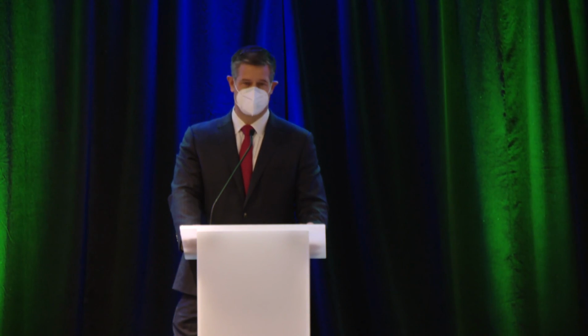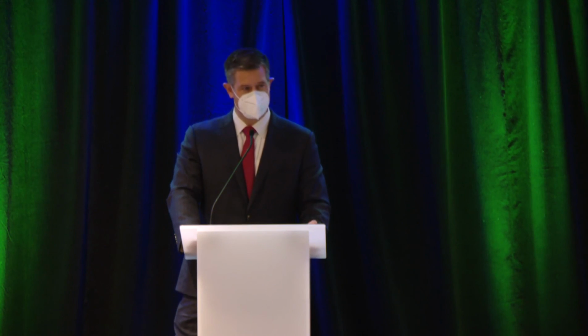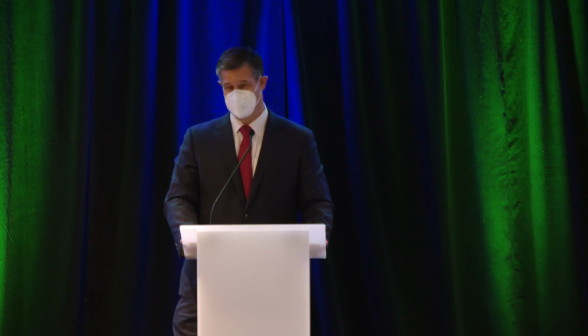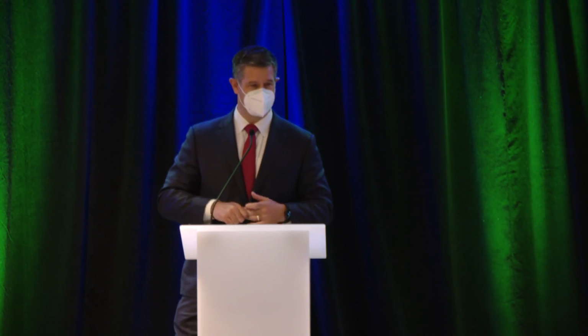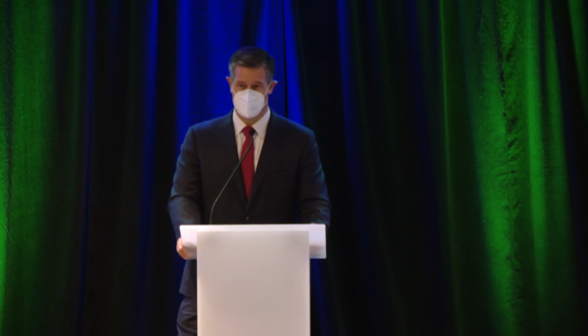Some technicians or nurses are better at getting that catheter past the full construct of the esophagogastric junction barrier than others. Personally, you can't really redo the study in most cases, so the cat's already out of the bag, so you have to figure out what to do when you don't have a catheter that's traversed the LES.